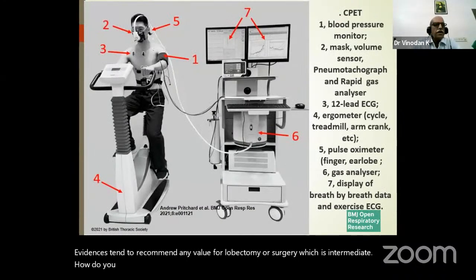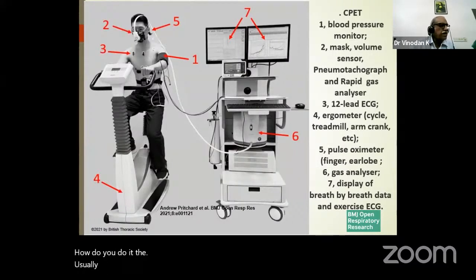How do you do it? The test is usually done with an ergometer. This is a machine which is used.